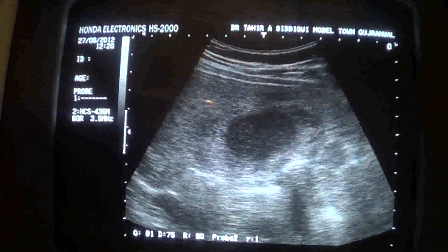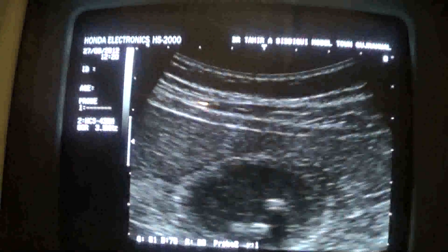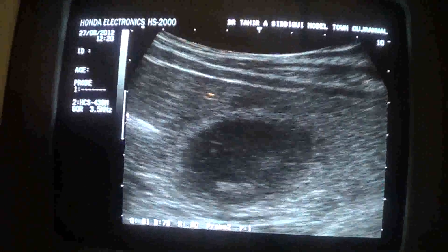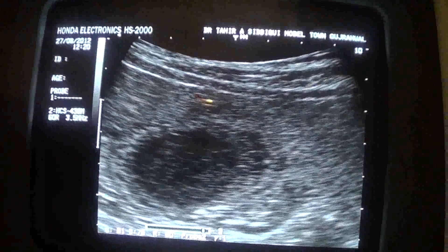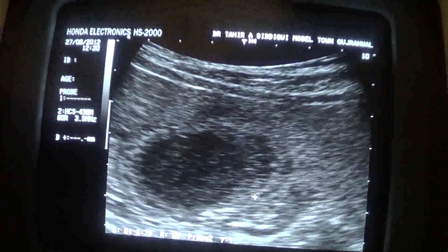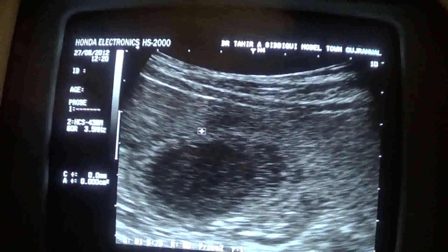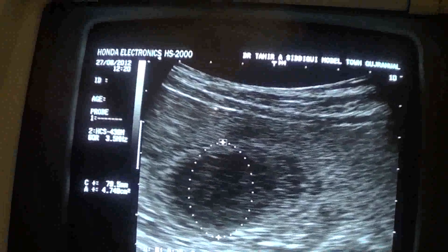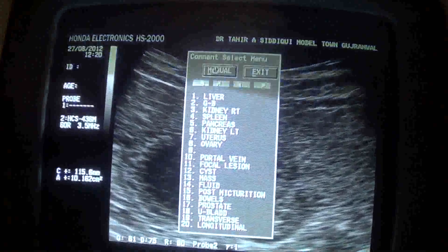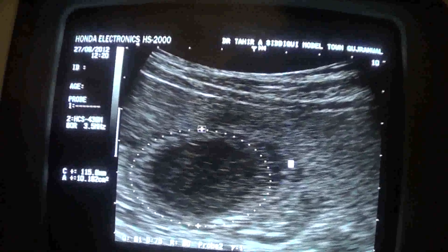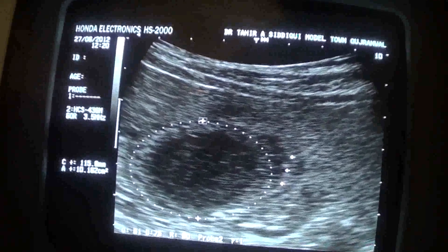Now this is the transverse section of the gallbladder. In this transverse section you can see a small amount of fluid seen around the medial wall of the gallbladder. This is the fluid — this area where I am adding the arrows.